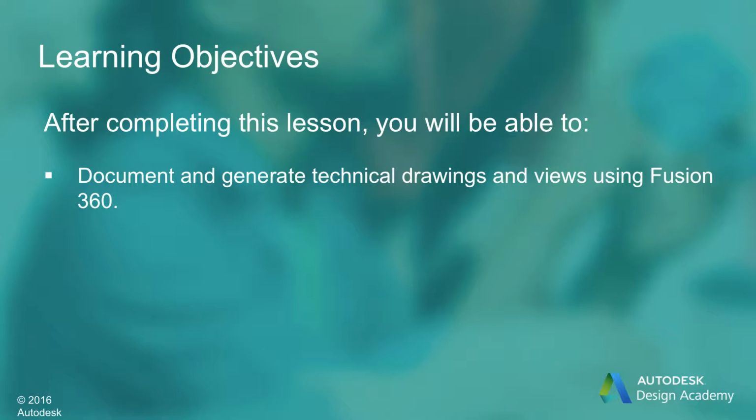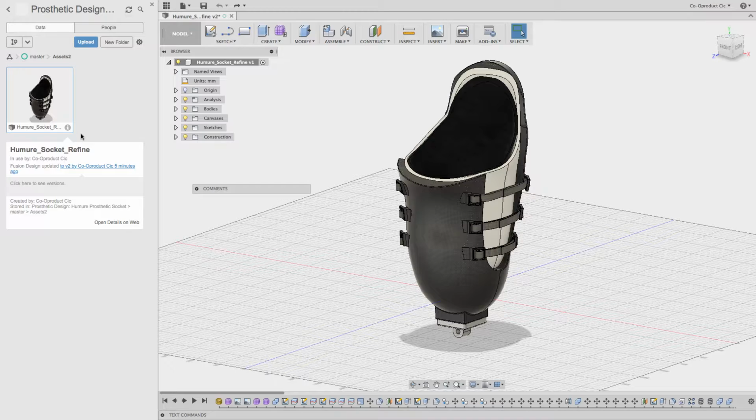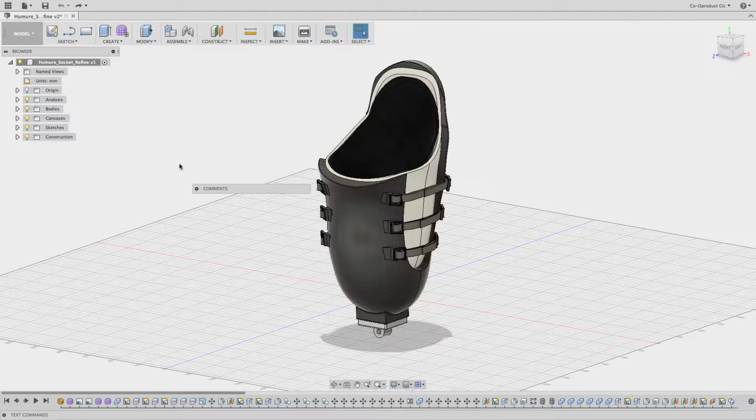After completing this lesson, you'll be able to document and generate technical drawings and views using Fusion 360. To begin, open the file Humure Socket Refine, then close the data panel. To document a design, it's easier to work with components than bodies. In the browser, right-click on the bodies, then select Create Components from Bodies.